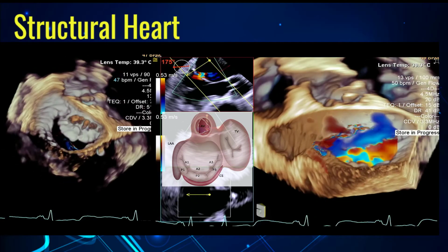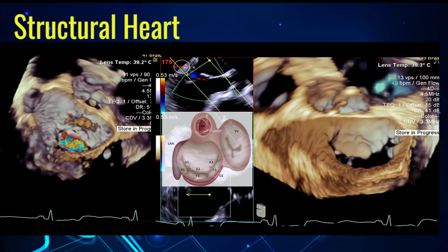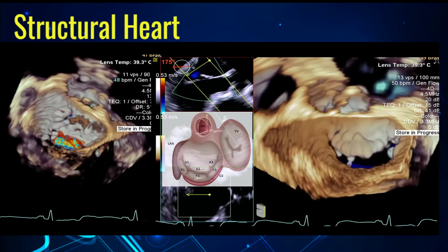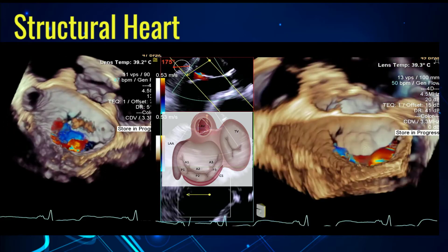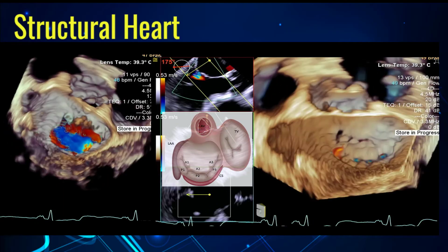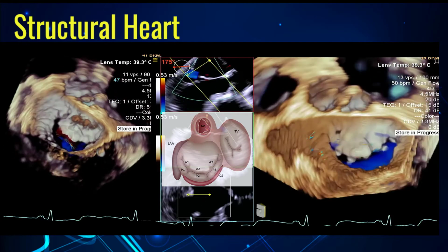Yeah, so it looks like you're cropping it down to the origin, so you're cutting off part of the atrium and trying to get down to the area of the vena contracta. Here that's a diastolic part, and then you're seeing the origin of the jet again in that A2, A3 region. So again, more towards the posteromedial commissure.